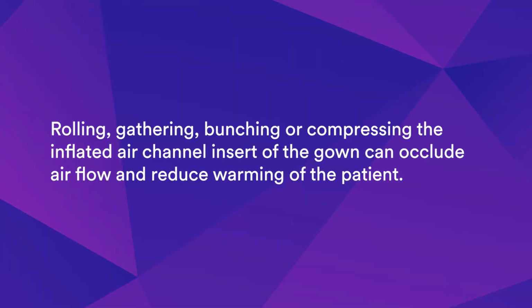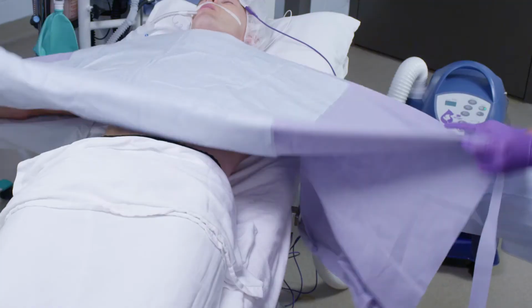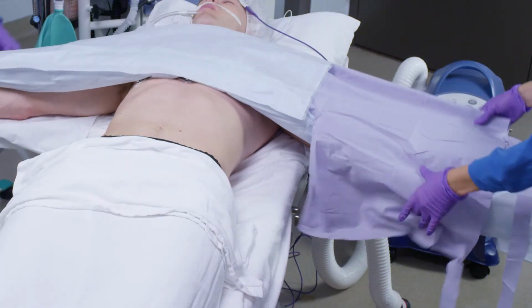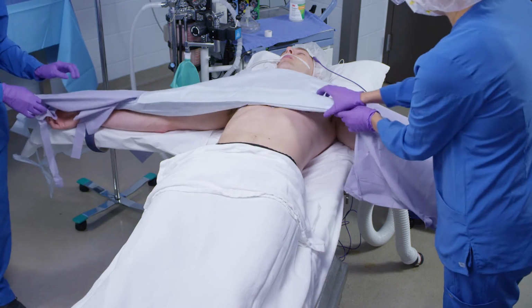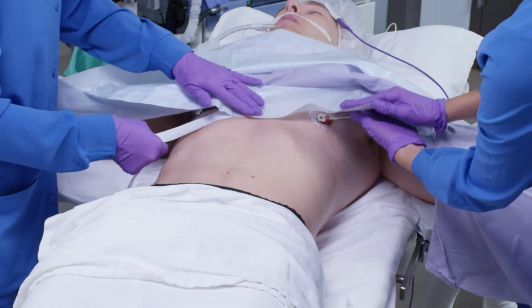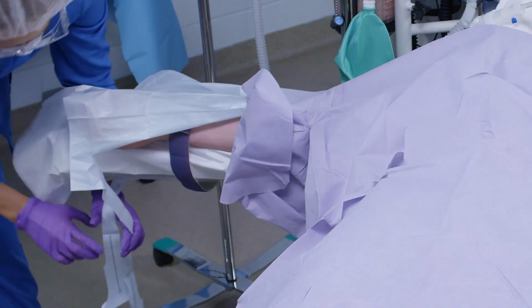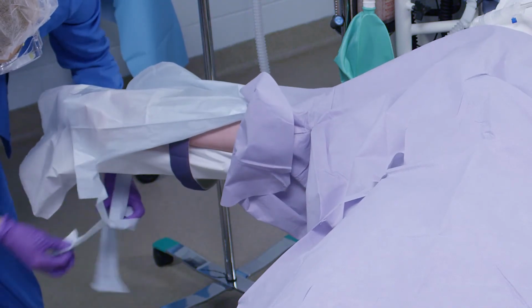Rolling, gathering, bunching, or compressing the inflated air channel insert of the gown can occlude airflow and reduce warming of the patient. For upper body warming with any gown, the gown can be rolled or accordion folded onto the top of the upper body area. The Flex Gown upper body insert can be deployed, secured with the adhesive strip, and secured to the arm boards via the perforated tie strips.